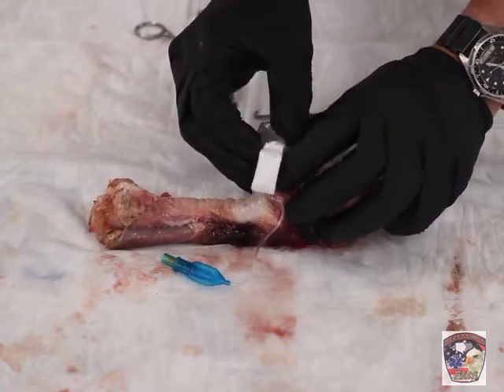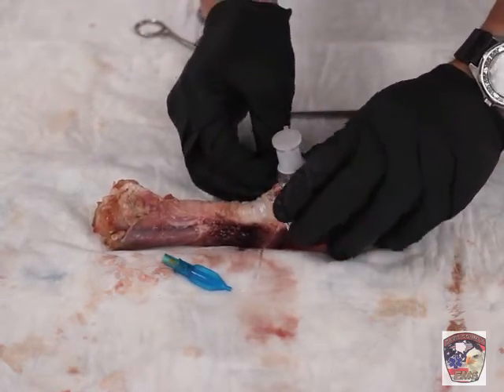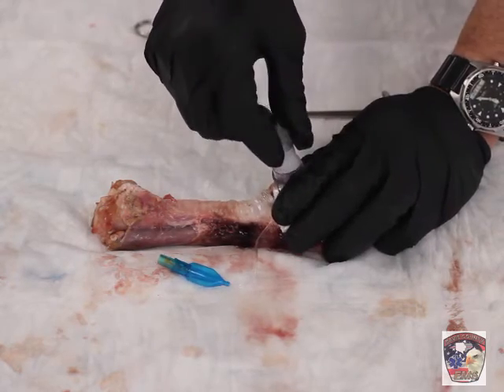And then we will stabilize the airway, secure it, and then remove the dilator.